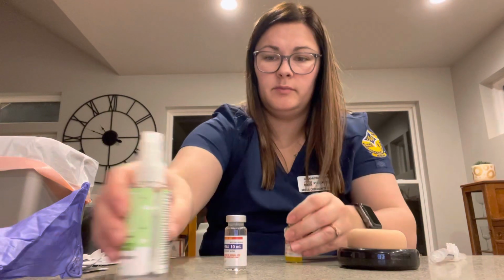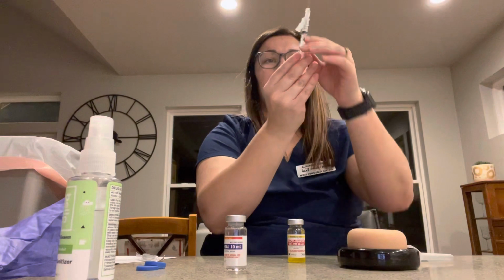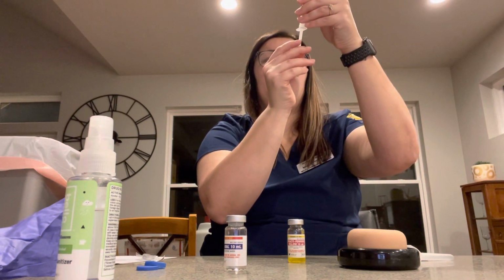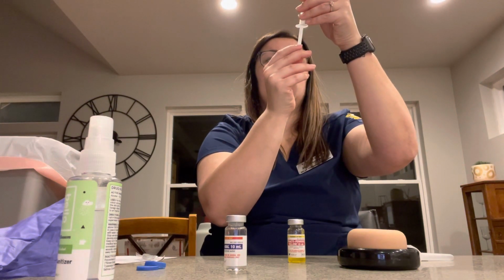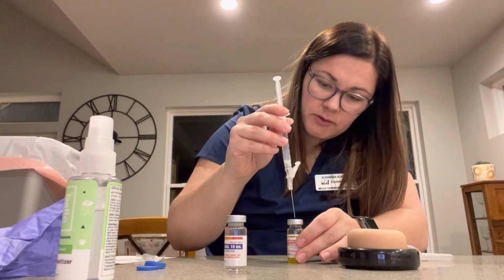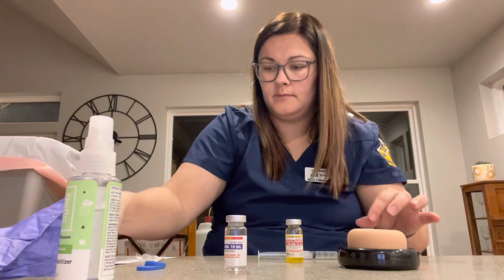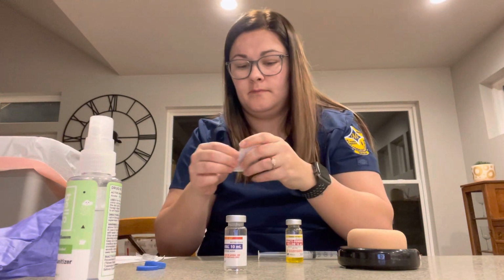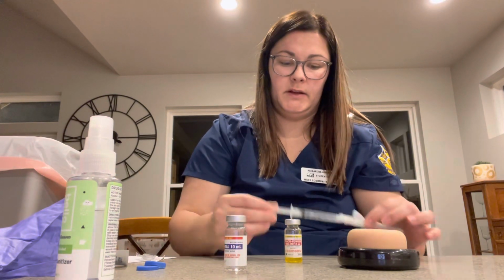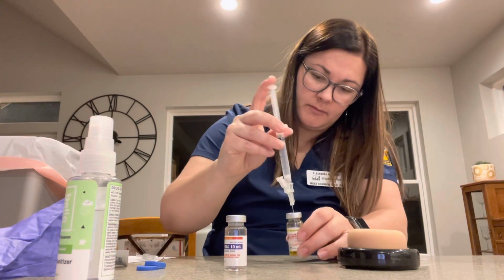Once it is thoroughly mixed, I will uncap my needle and once again pull back 2.8 milliliters of air and add that to my clean vial, giving that a second to dry.